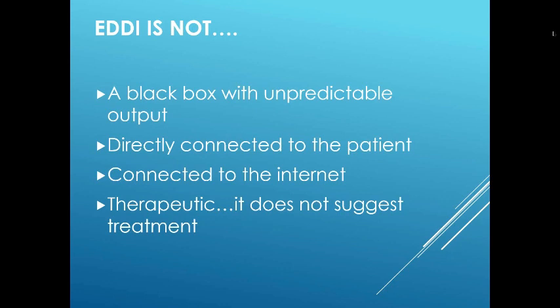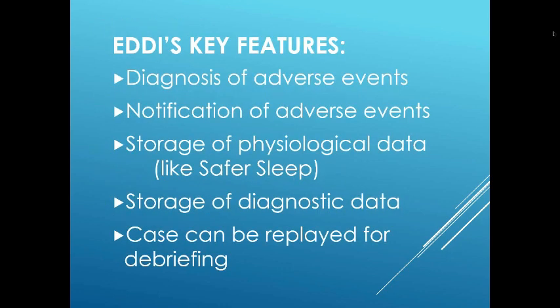I will stress again, it does not suggest a management plan. The anaesthetist is in sole charge of the patient's treatment. Neither does it replace the anaesthetic monitor. EDDI has the ability to recognize patterns in the physiological data that suggest some adverse events. When you think of blood pressure in the various patients you manage, you might ask how EDDI can cope with the variation between patients.